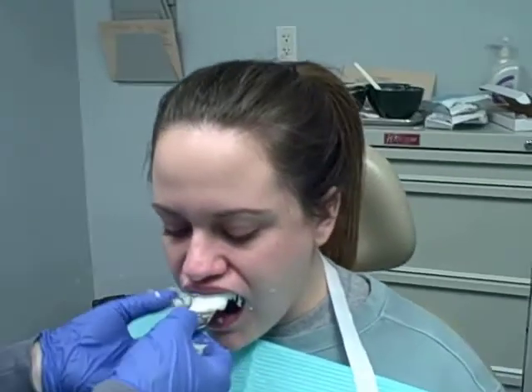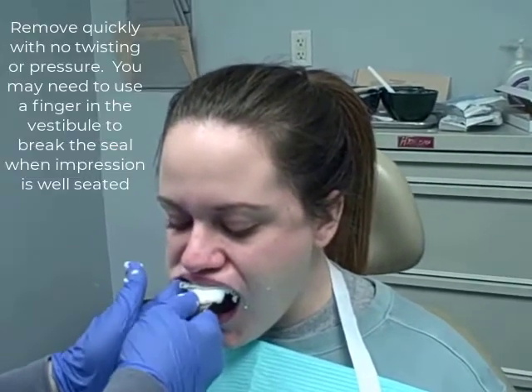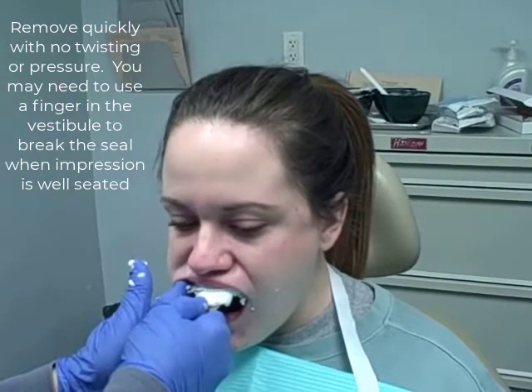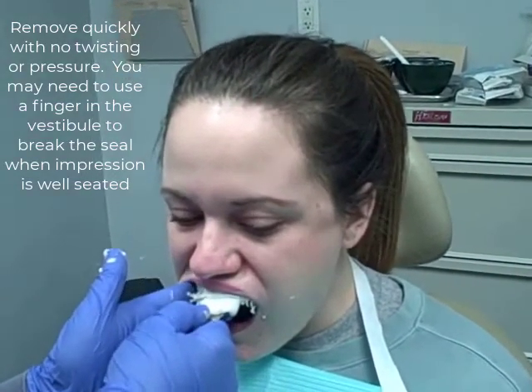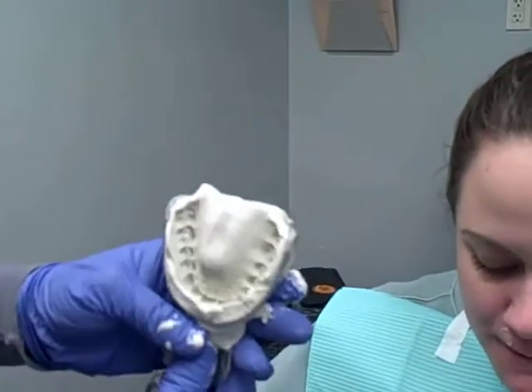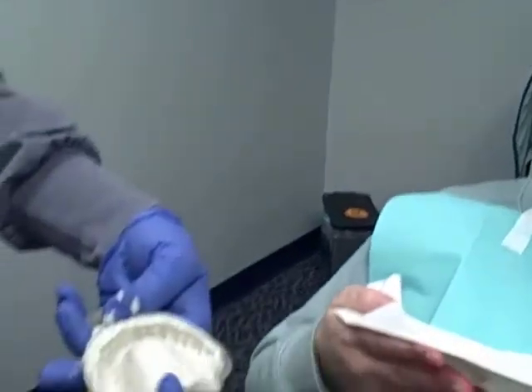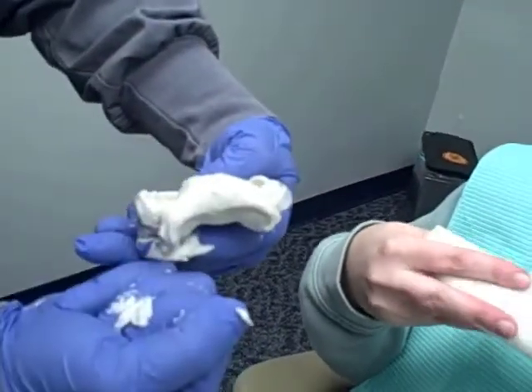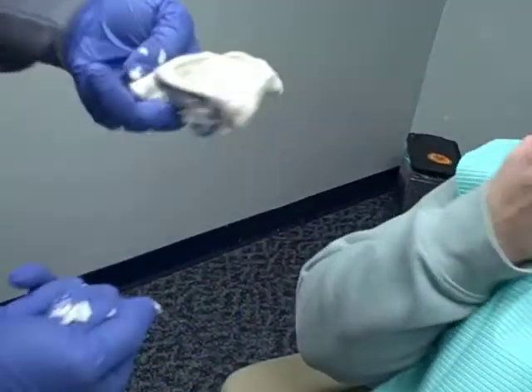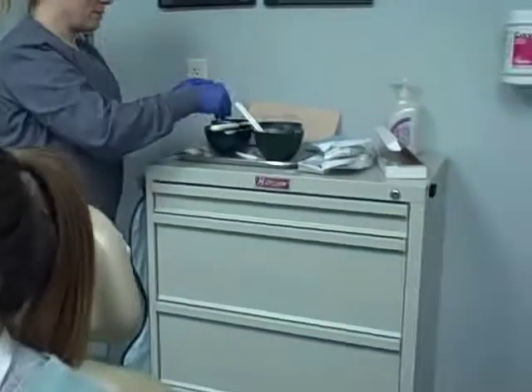And I'm going to come around, put my finger under here, kind of pop the seal. And we've got a good maxillary impression. We didn't get too much going down the back — just a little bit, not too much. She did a great job. Not all patients are that cooperative.